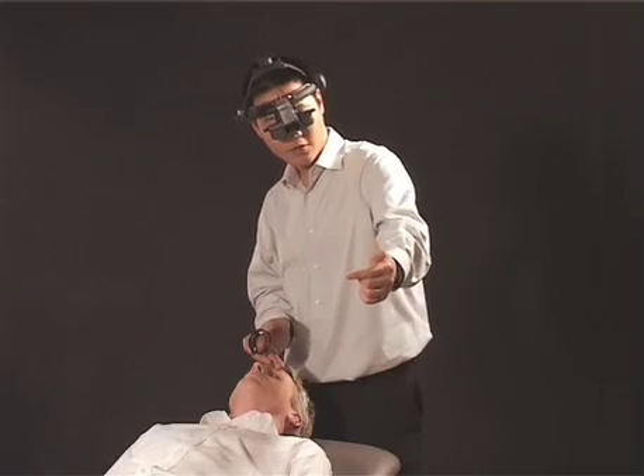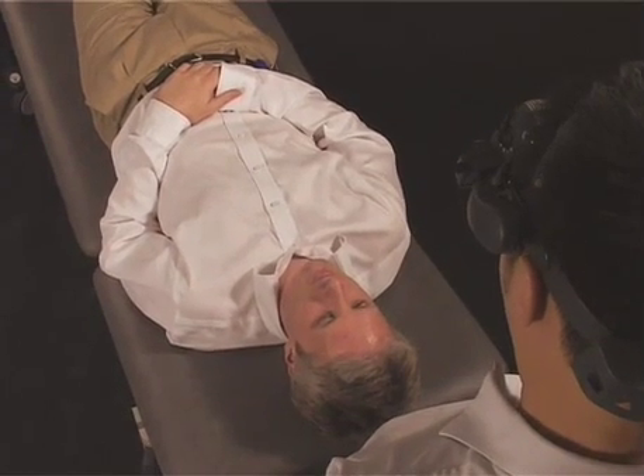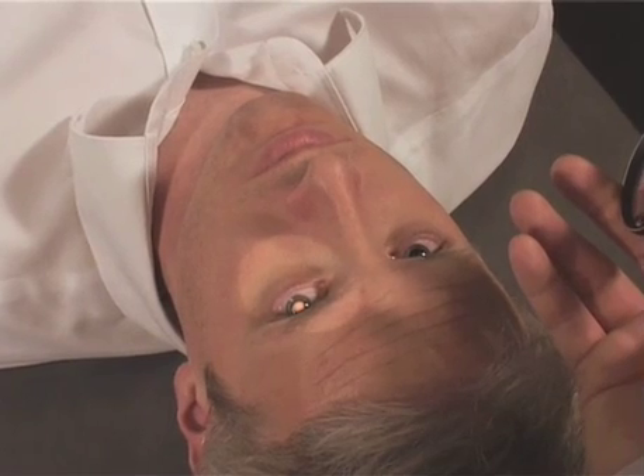Start by getting the patient to look in the direction of the area of interest and position yourself diametrically opposite this line of gaze. First illuminate the fundus without the condensing lens to make sure that you're lined up with the pupil and can see a clear red reflex.